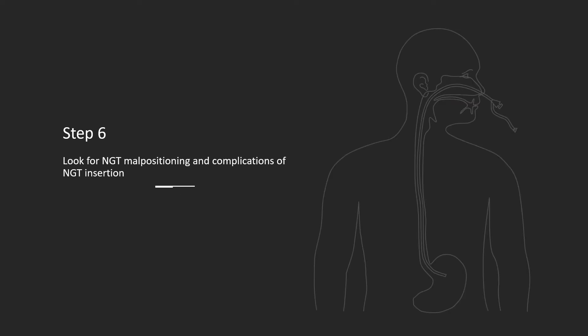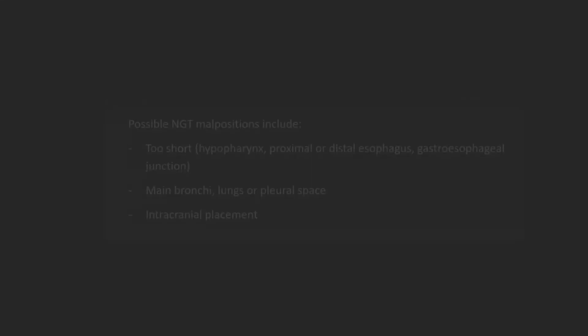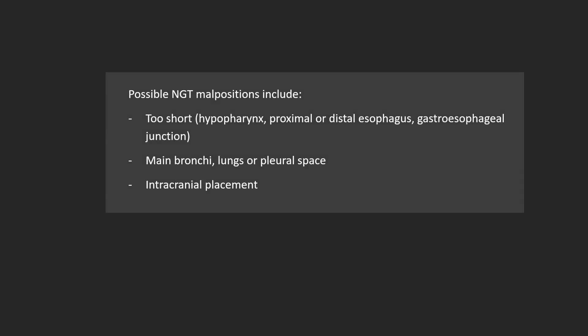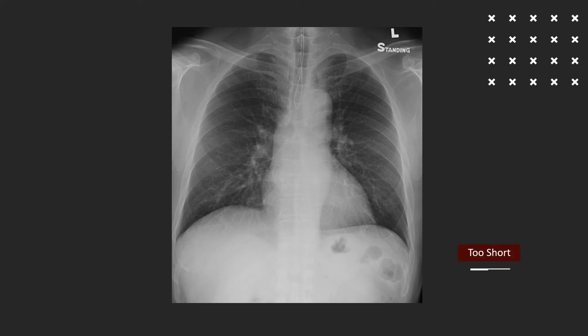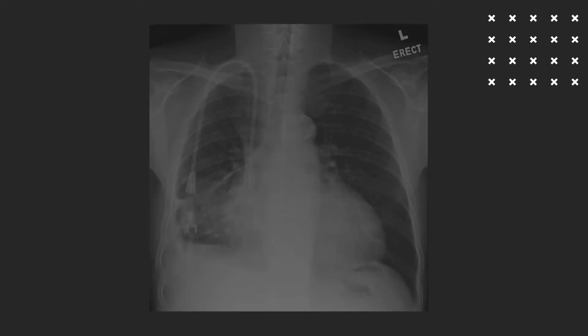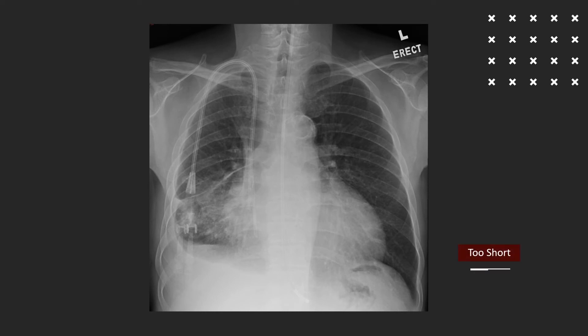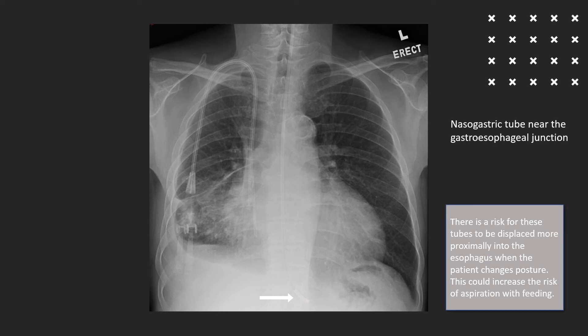Look specifically for nasogastric tube malpositioning and complications. The nasogastric tube is commonly too short, which could be due to the distal end looping upwards and returning to the hypopharynx or the upper third of the esophagus. The tip of the tube could also simply be too proximal within the distal esophagus, or even below the diaphragm but around the gastroesophageal junction rather than fully within the stomach.